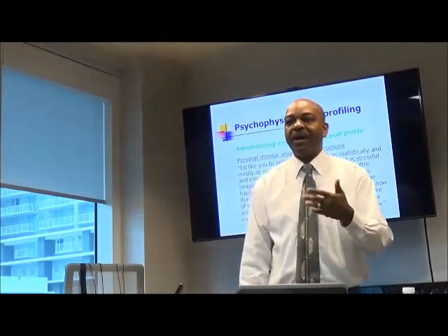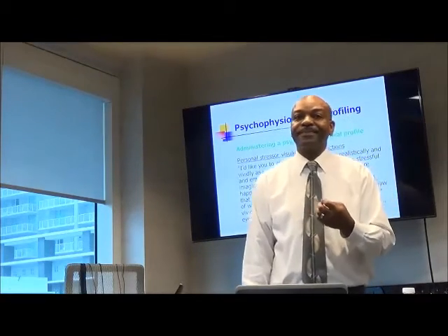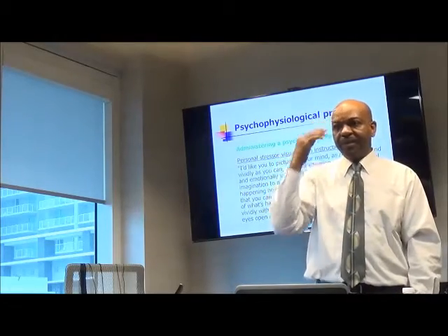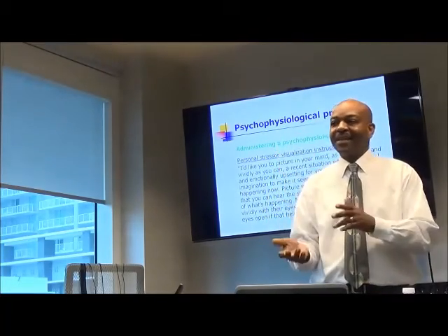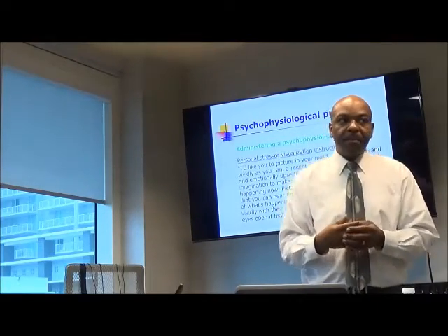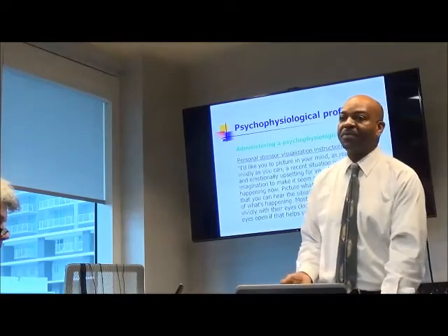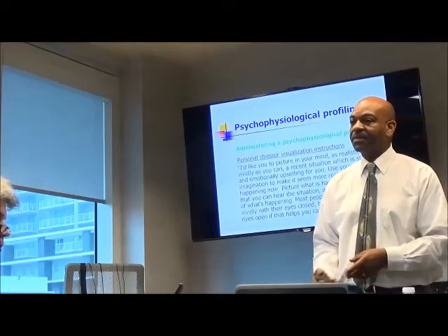The other part of why I can understand why somebody might say only to think about it is because as they're talking, you could get some artifact. So if I have sensors here and they're talking, with the expressions of their face, you might pick up some muscle activity that's not necessarily stress, but just mechanical from expressions. And even if you put it on the trapezius, some people talk with their hands, or if you put it here, you can get some artifact from the talking. So you want to take that into consideration.